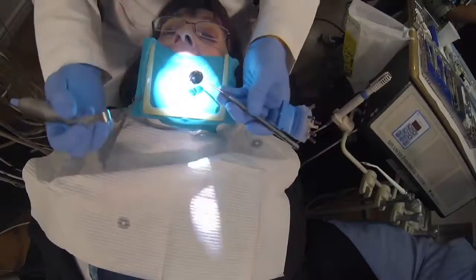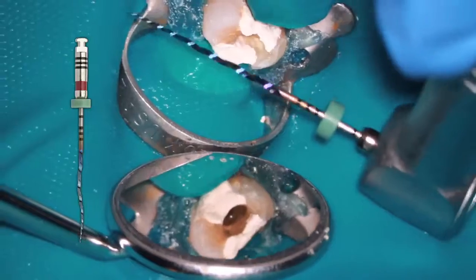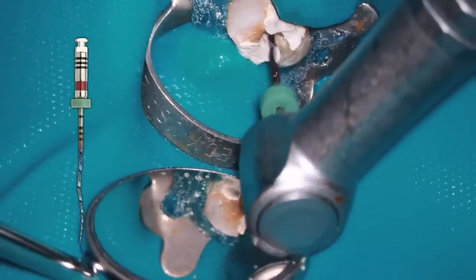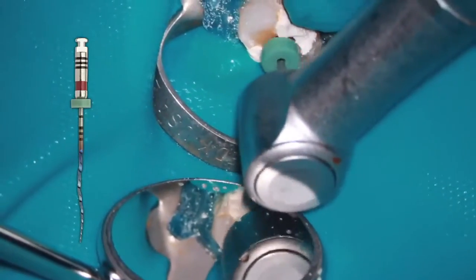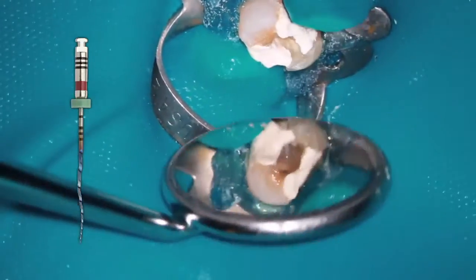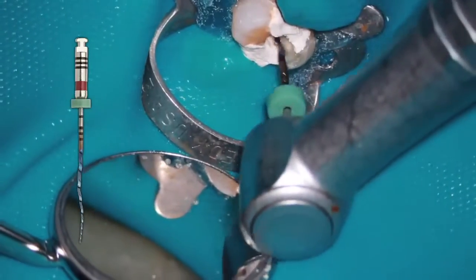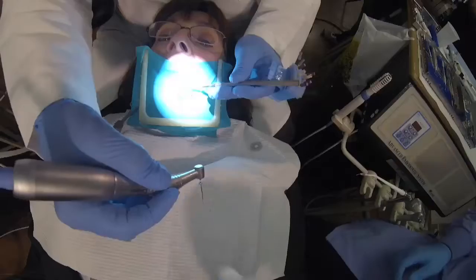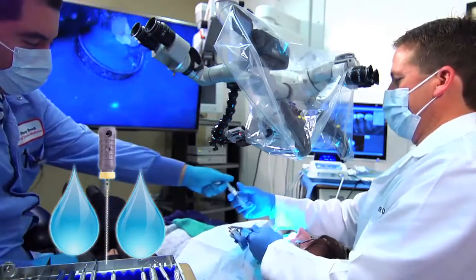So after using the 2006, now going with the 2506. Not only is it a change in tip diameter, but also its points of contact. And with its unique geometry, we're going to very gently, 1, 2, 3, and right to working length. And that's the buccal aspect of that. And very gently, I'm going to walk down the lingual aspect just once. And that's just up top coronally, not really worried about apical. Excellent. And now, irrigation.